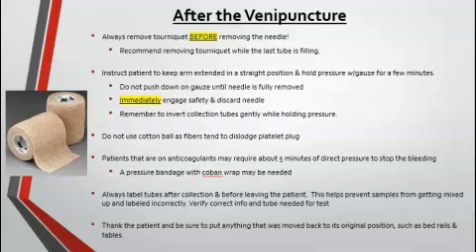Patients that are on blood thinners or anticoagulants, again, they can need a little bit longer for pressure to be held on the puncture site, because the blood takes longer to clot for those patients. It might be a good idea to use a pressure bandage like Coban on a patient that you're having a little bit more trouble with to stop bleeding.